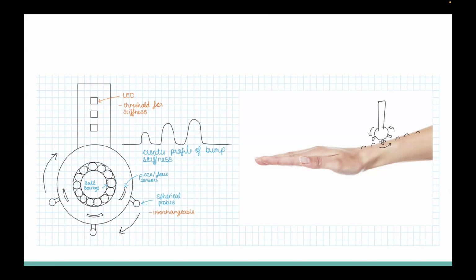So in the same measurement, you could get the change between the normal skin elasticity and the elasticity of the bump as well. So it would measure the change, so that it could always be relative to the patient. And then I was thinking of having some electronics inside and some LEDs. Maybe we'll have a threshold, for example, if it's this difference, then there's onco. So it's something really fast, so you can just roll it along your skin. I know Manu mentioned a ballpoint pen, so I just thought of something quick like that. But we haven't been able to make any measurements so far.